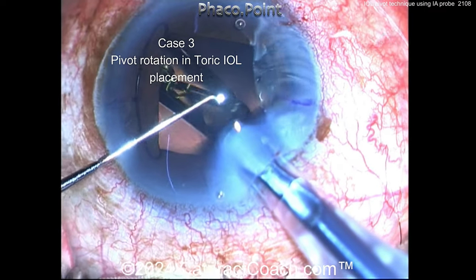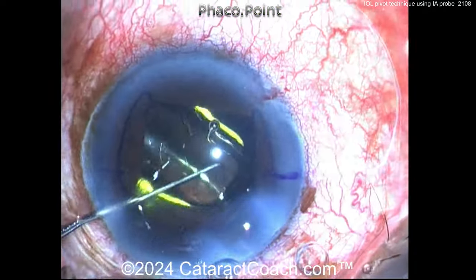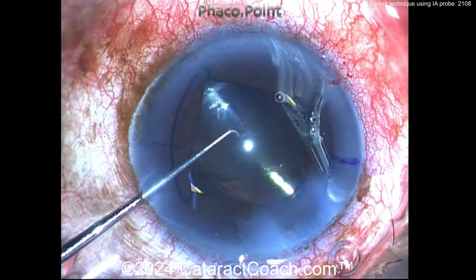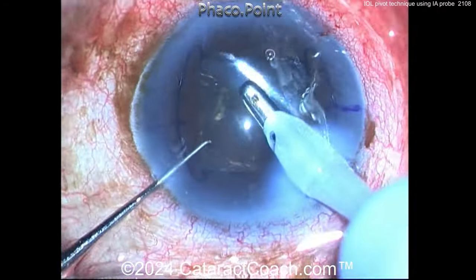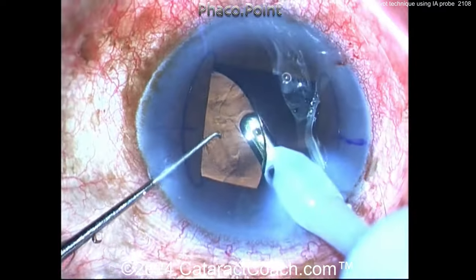Here we're demonstrating pivot rotation of a toric lens. You can see a smaller pupil with a pupil expansion ring. Here's the IOL — a toric monofocal lens — going into the capsular bag. The surgeon is going to use the pivot technique to rotate it to the desired position. First, taking out some viscoelastic from in front of the IOL optic.